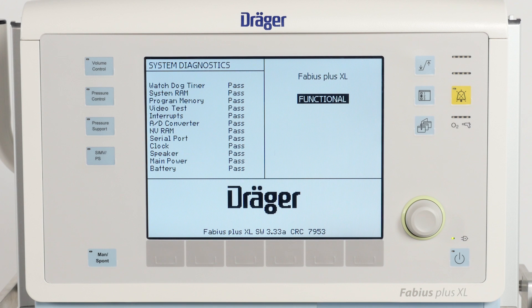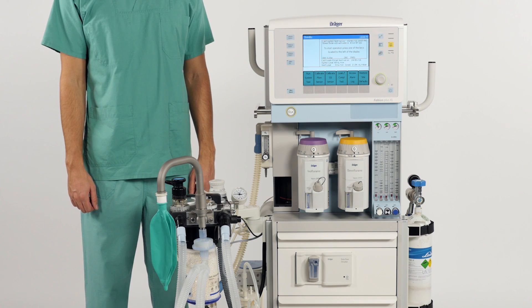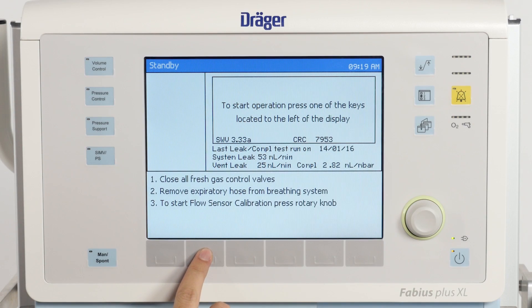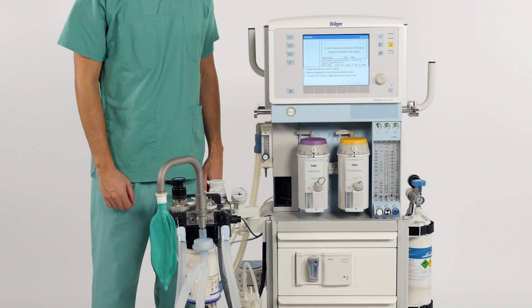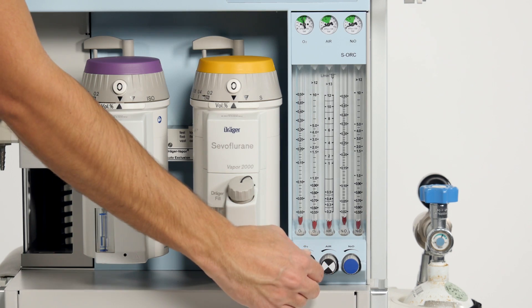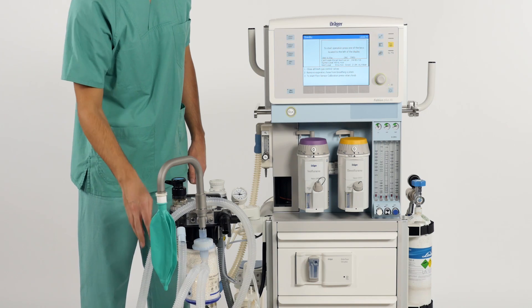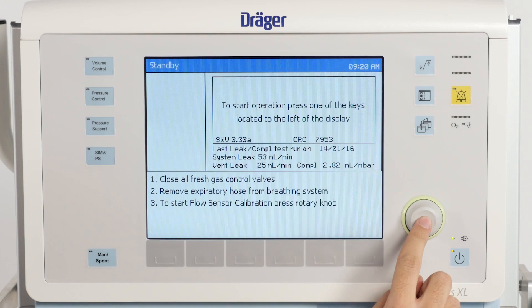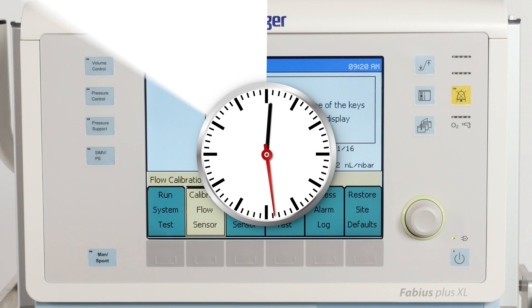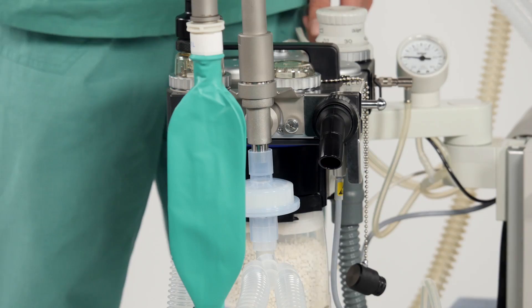Next we perform the necessary calibrations and tests. Calibrating the Fabius sensors is really easy. To calibrate the flow sensor, press the Calibrate flow sensor key and follow the instructions given on the screen. Close all fresh gas control valves. Remove the expiratory hose from the breathing system and start flow sensor calibration by pressing the rotary knob. After the calibration is finished, reinstall the expiratory hose onto the breathing system.